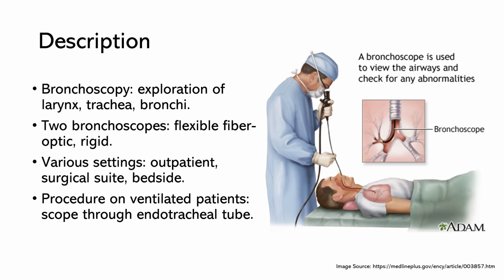We might be in an outpatient clinic or a surgical suite under general anesthesia. We might even be at the patient's bedside with local anesthesia and moderate sedation, providing comfort for our patient. Imagine a patient on mechanical ventilation. Well, we can insert the scope right through their endotracheal tube. So you see, bronchoscopy is not just a procedure. It's a testament to our relentless quest to improve patient care.